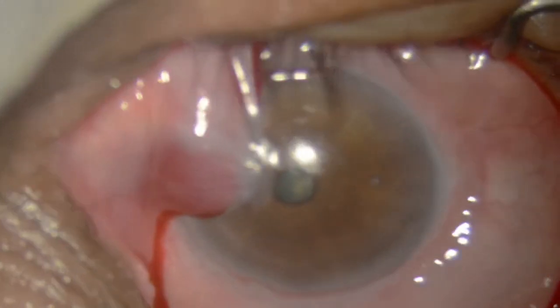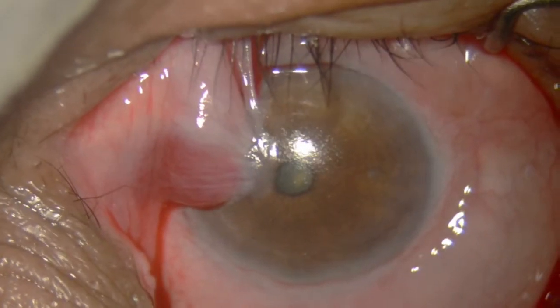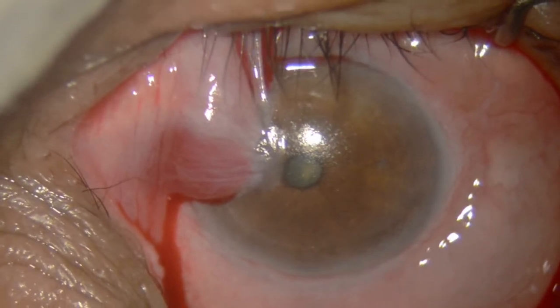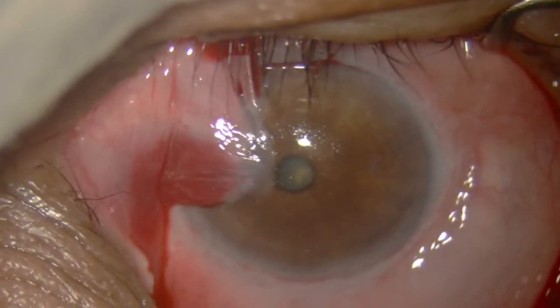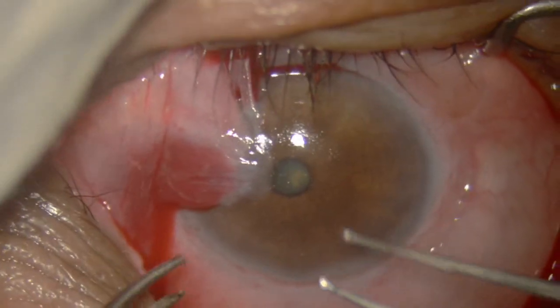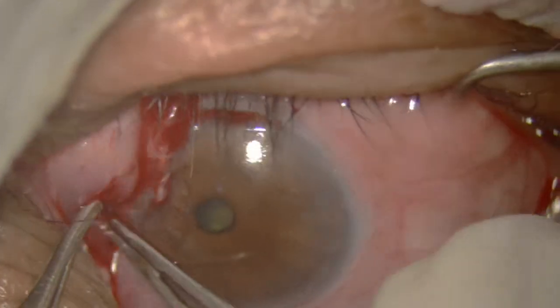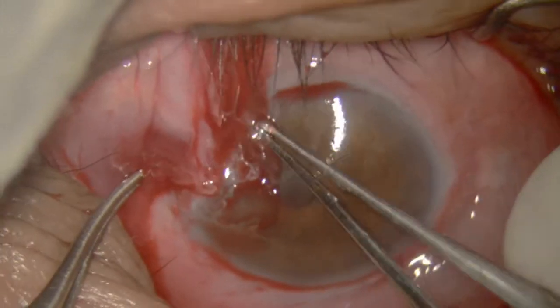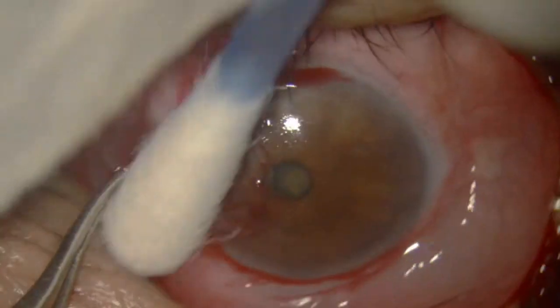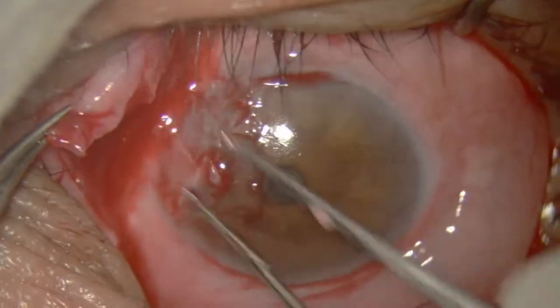What I am going to do is peel off this huge pterygium — I do not cut it. I retract it towards the sclera and tie it there. You will see: just peel off the pterygium.